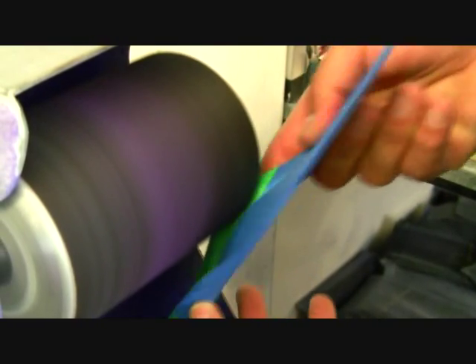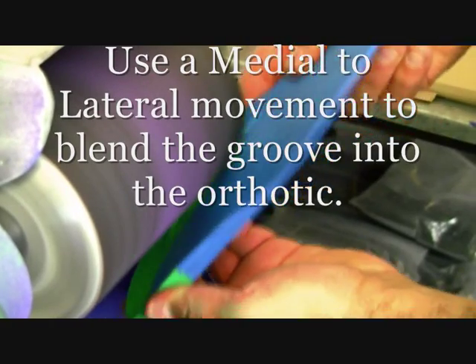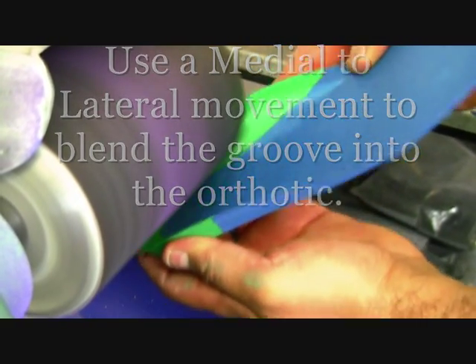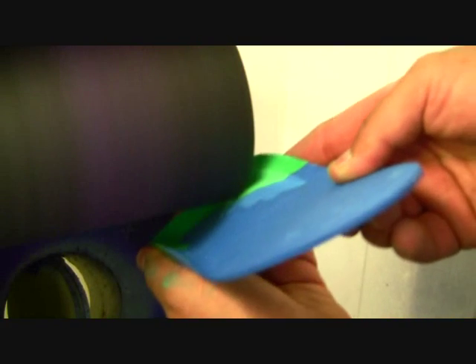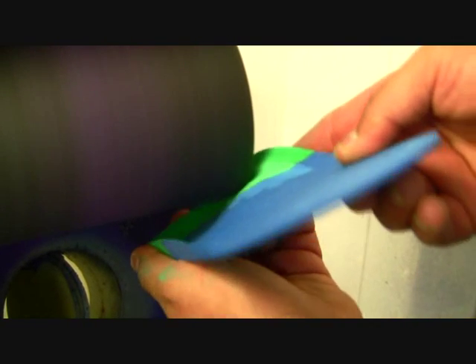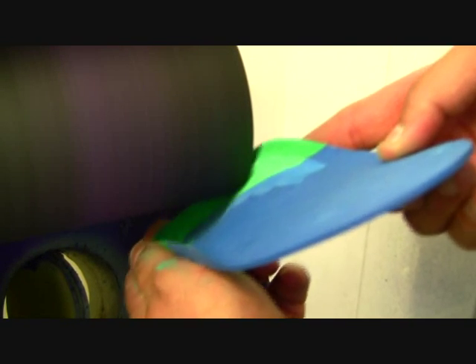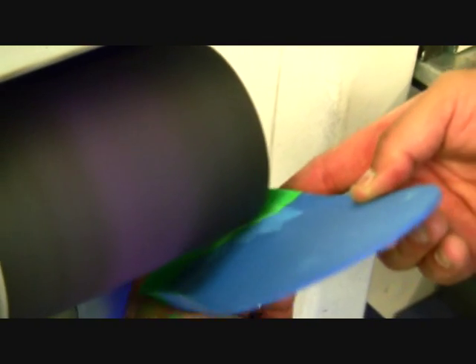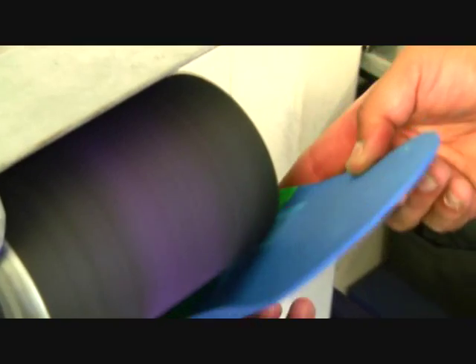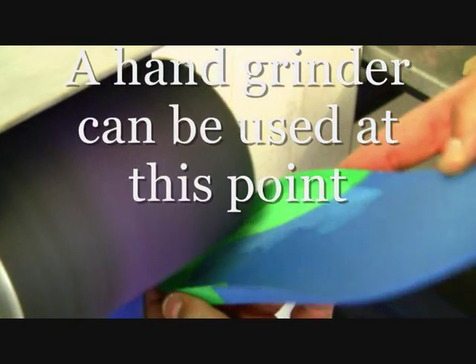Blending the groove into the orthotic is done by using a medial to lateral movement. You can see the technician using that movement to blend the base of the groove into the rest of the orthotic so that it is comfortable for the patient. If you find this difficult on the grinder, you can go back to using the Dremel, as it is a little easier to use on this part of the orthotic.